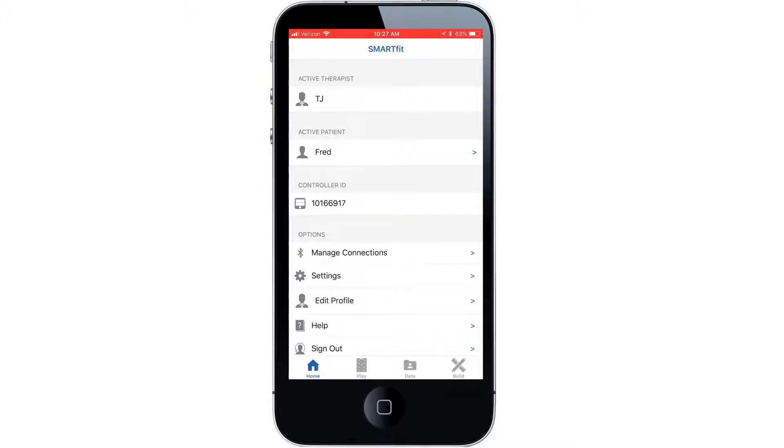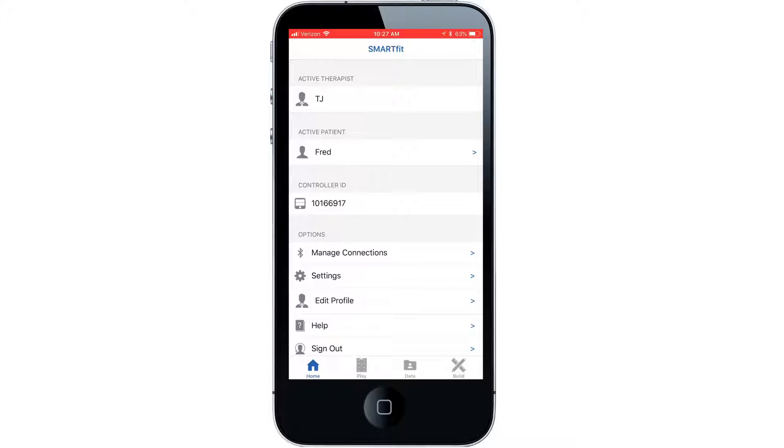Now I'll show you how to access the free activities in the system or create activities and assign them to this patient. The first activity will be selected from our list of video supported free activities list. The second activity will be custom built for this patient's condition.